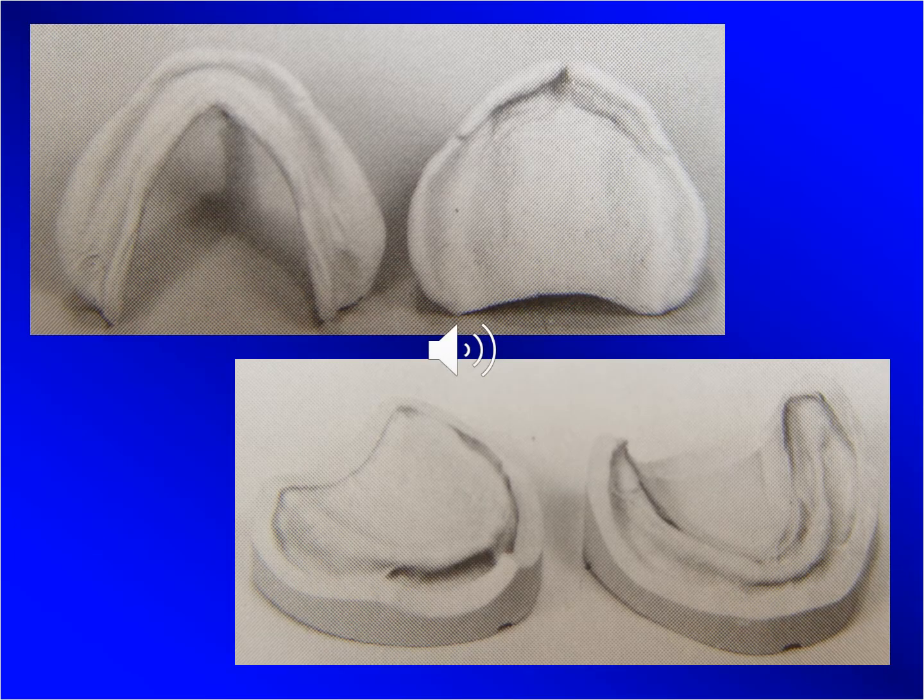Now just to have a revision of our complete denture construction steps. We start with recording of the fitting surface using a primary impression, after which we construct a special tray that will be used to make a final impression from which the master casts are going to be made, and which are the replicas of the fitting surface that will be considered the final record of that fitting surface, according to which further procedures are going to be conducted.